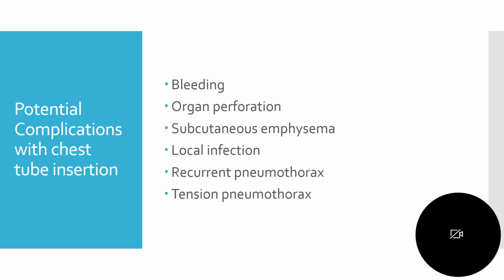Now, all of this you'll learn more about as you go into your clinical areas, and it would be really great if during your rotations you have a patient with a chest tube. Last but not least, here are some potential complications with chest tube insertion.